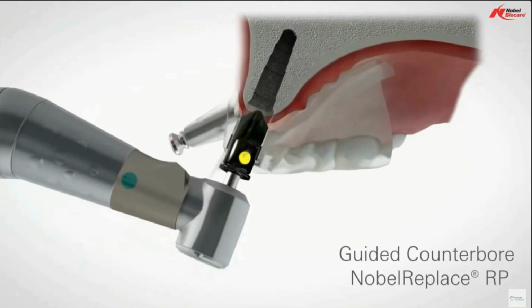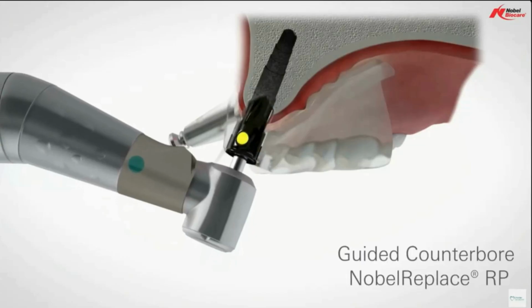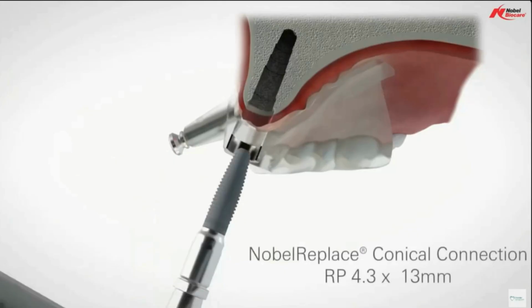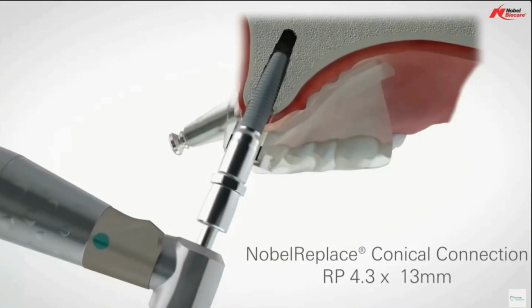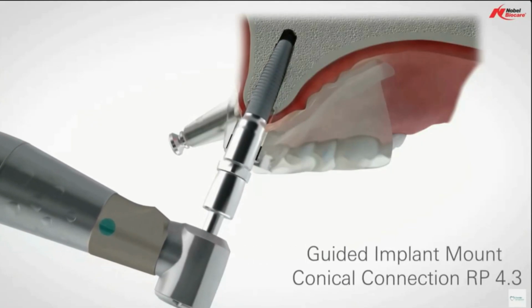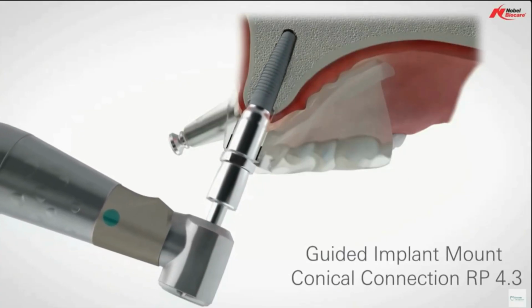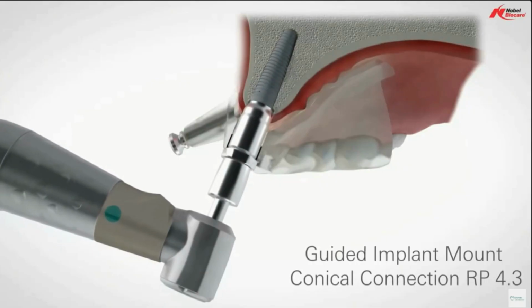We can go in if we're subcrestal. There are bone mills that are used just to go in and profile the bone so that the healing abutment will seat. This is something that we experience quite often, where we've designed a crown, but the crown won't seat all the way. It's mainly because there are remnants of that bone that are interfering with the components. This one has a little bit of a flare to that implant mount, and if that rides on the bone or impacts the bone, then it holds it up.